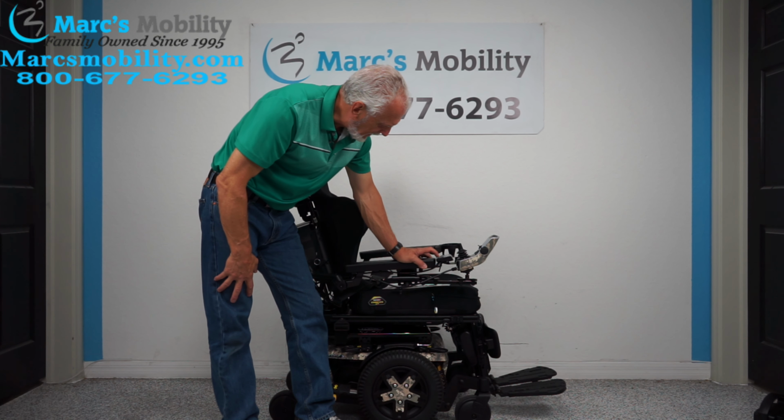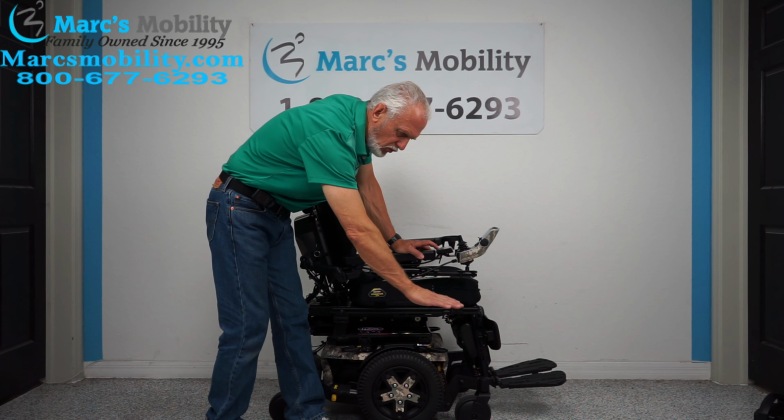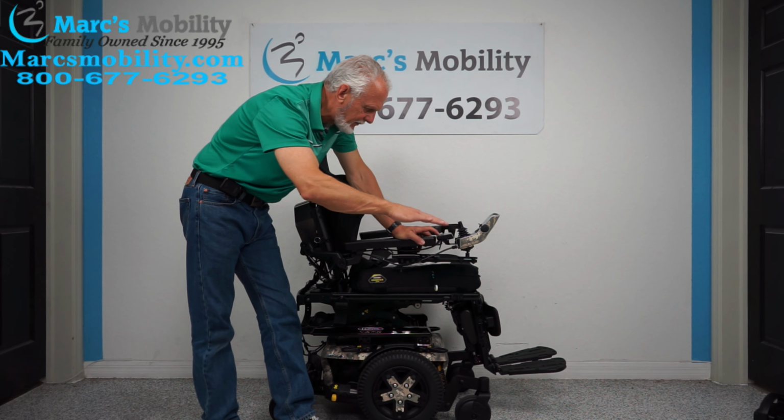So if you hold the button down for a second, the seat will start going up. So you're going to start roughly at 22 inches when you're down. So if you add your 12 inches, by the time you're all the way up, you will be at 34 inches, okay? So the nice thing about the seat lift is you can be eye level talking to someone. That's why they call it iLevel, okay? But also you can do your dishes looking down. You can get into the second cabinet at your house, or you can just walk with someone at eye level.